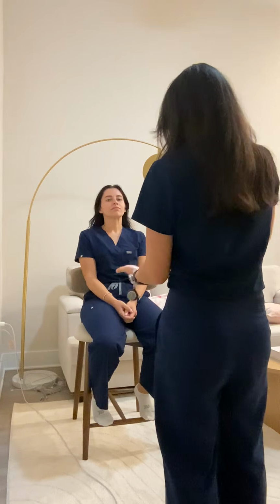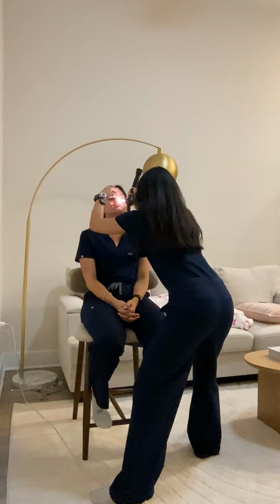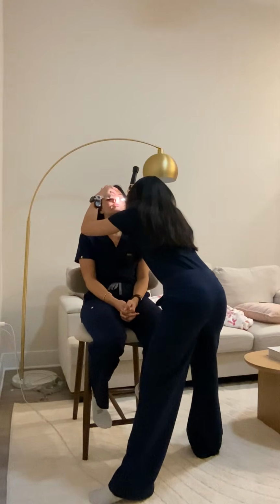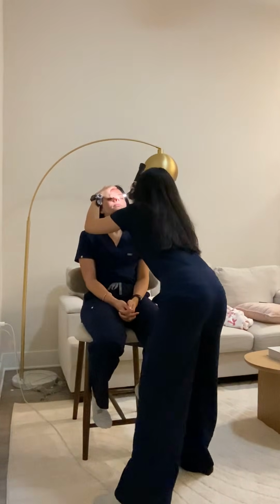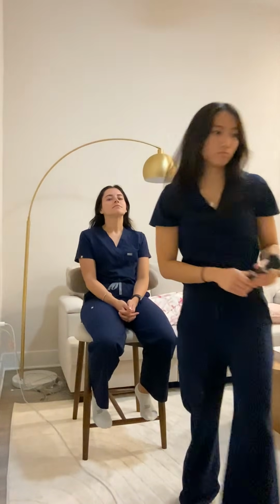Next, I'm going to use this. I'm going to put it upside down. I'm going to check your nasal mucosa. Once I visualize your nasal mucosa, I'm also checking for any nasal septum deviation or perforation on both sides bilaterally. And then I'm also going to be checking the turbinates for polyps bilaterally. All right, that concludes the nasal examination.